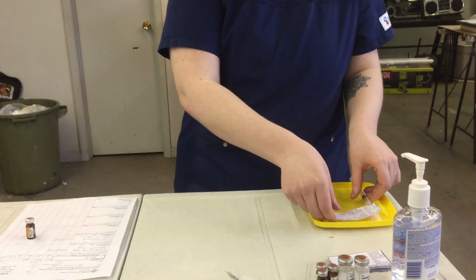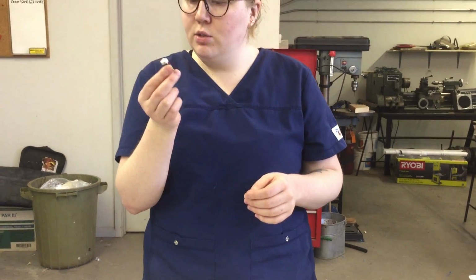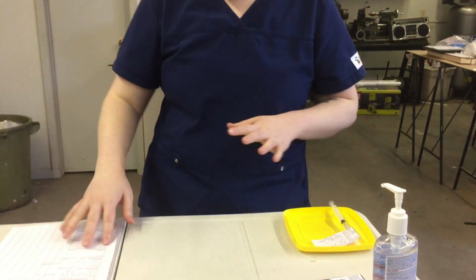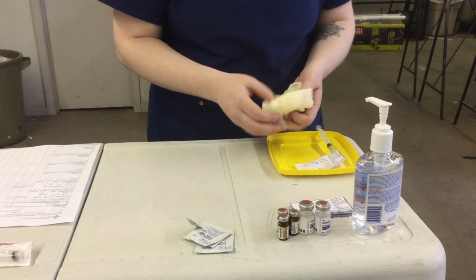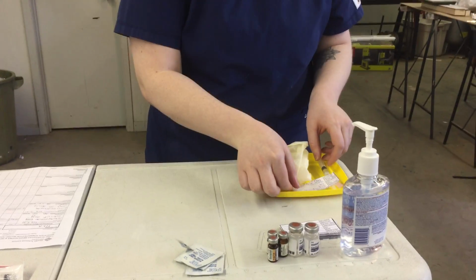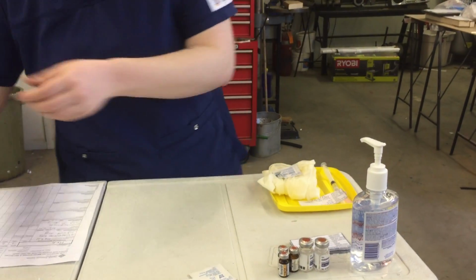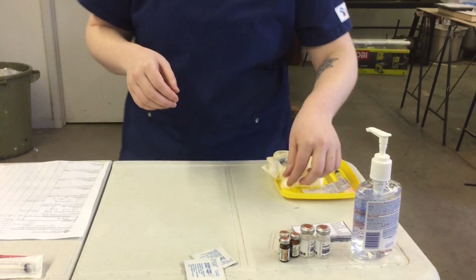now. So I'm just going to get my stuff ready to go into the patient's room. This was a single-use vial, so I would have discarded this in the proper med waste bin. So after I've done that, I'm just going to get the rest of my supplies. So I have my gloves, my clean gloves, an alcohol swab, a cotton ball, and my MAR, and I already have a pen in the room.